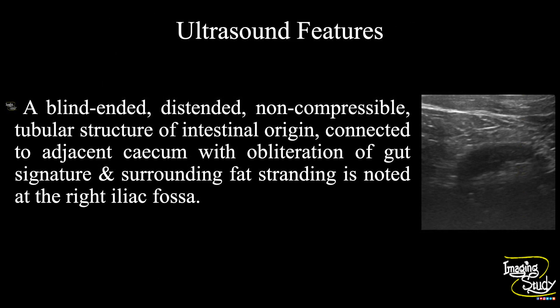In summary, a blind-ended distended non-compressible tubular structure of intestinal origin connected to the adjacent cecum, with obliteration of gut signature and surrounding fat stranding, is noted at the right iliac fossa — indicating a case of acute appendicitis. You may also note the early appearance of gangrenous change.